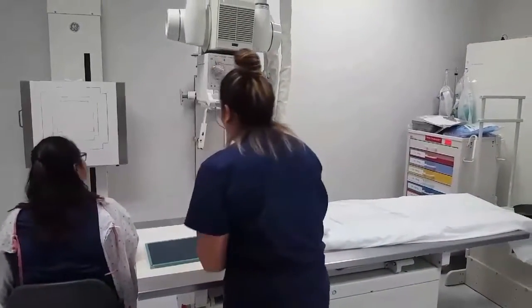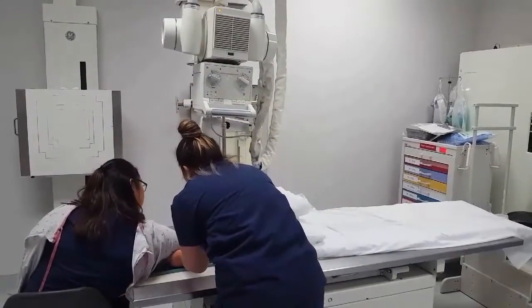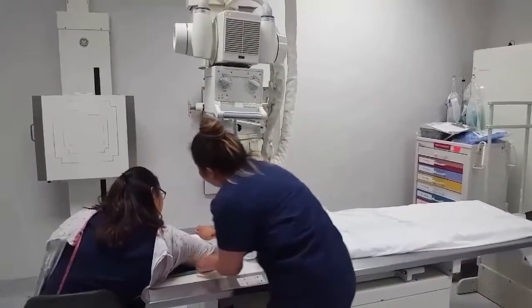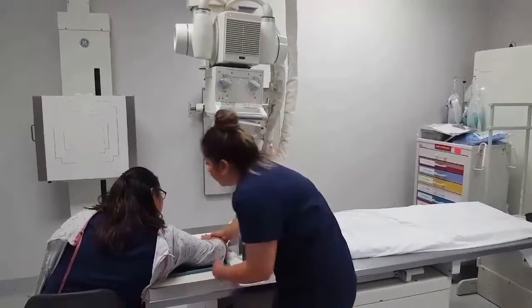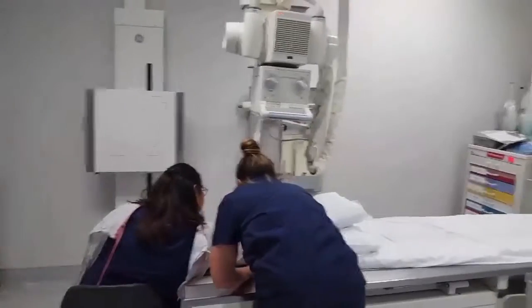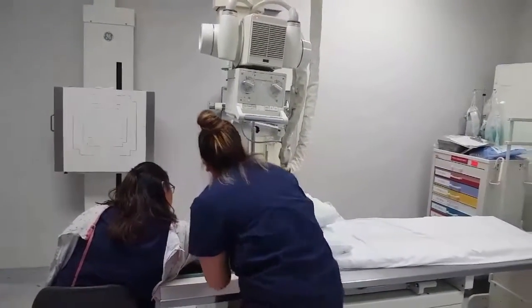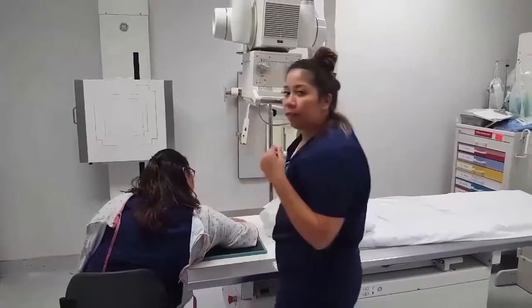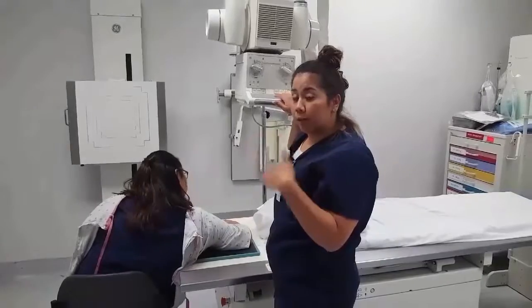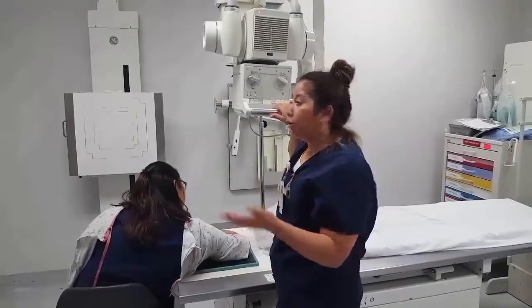And Ms. Garcia, if you could go ahead and extend your arm out. Go ahead and place it. There you go. So making sure that the hand is in prone position, and also our elbow is at a 90-degree angle. So once we have that there, then our center ray is going to be 5 to 15 degrees towards the elbow and at the shoulder joint.